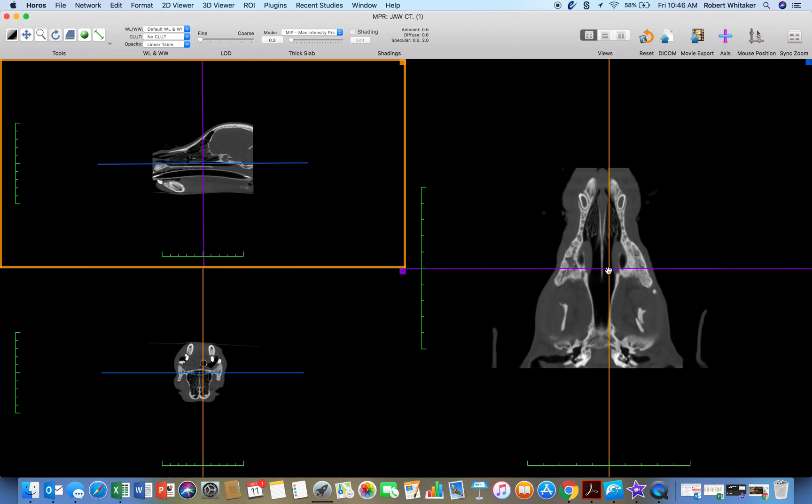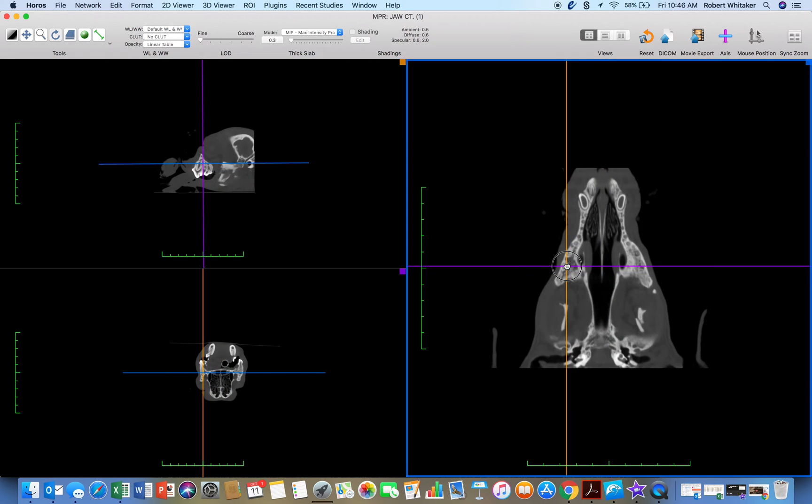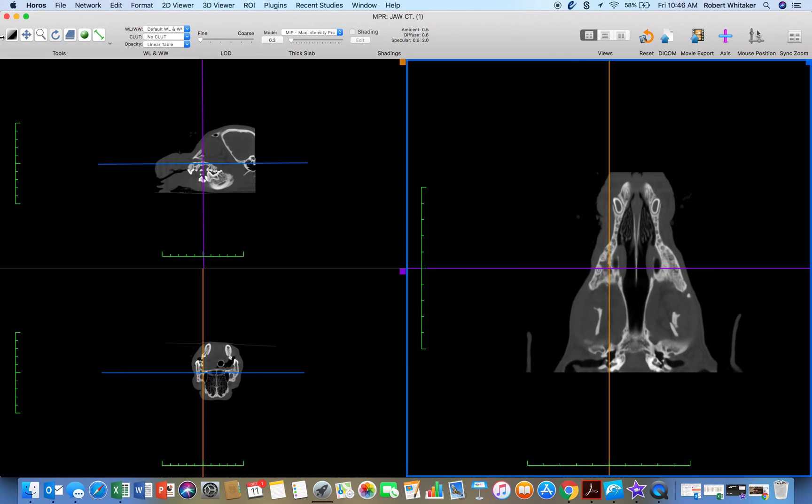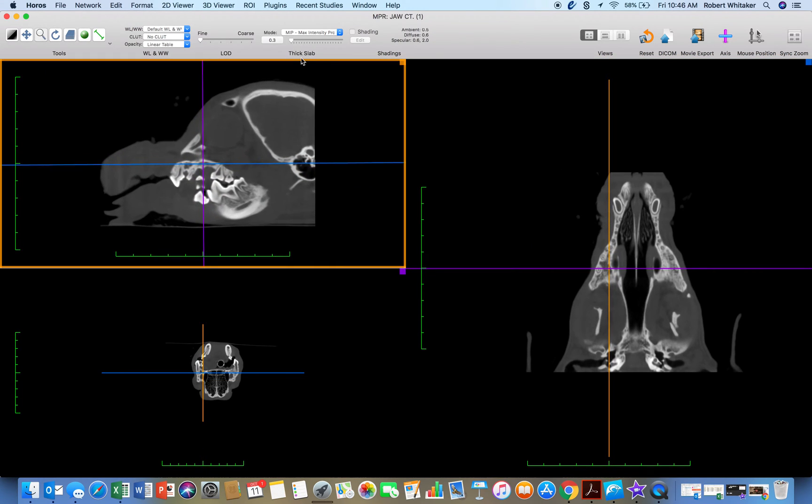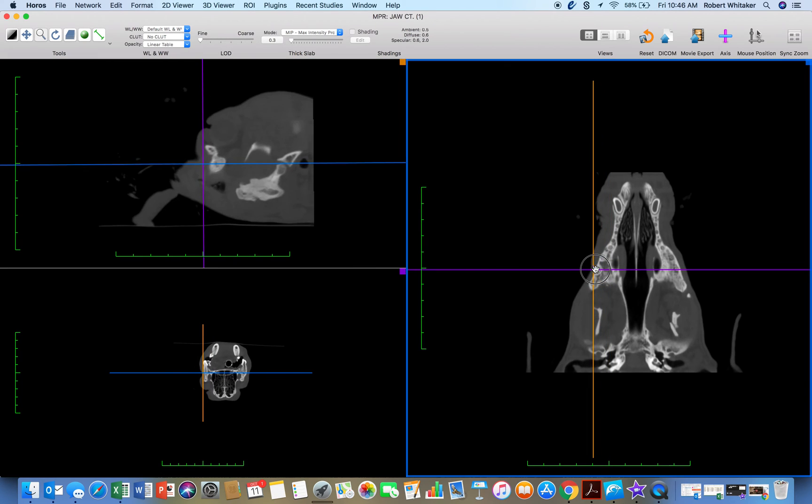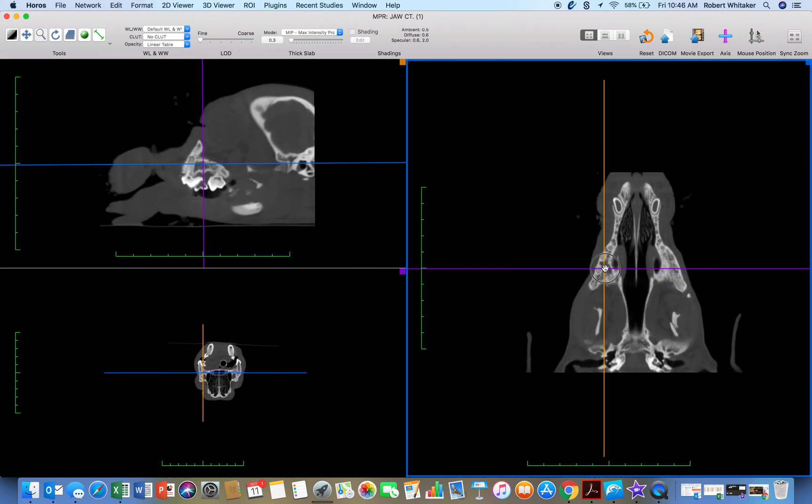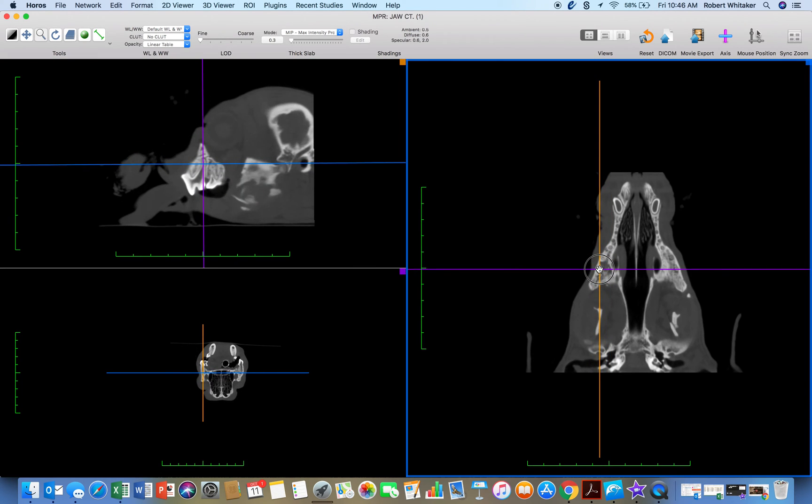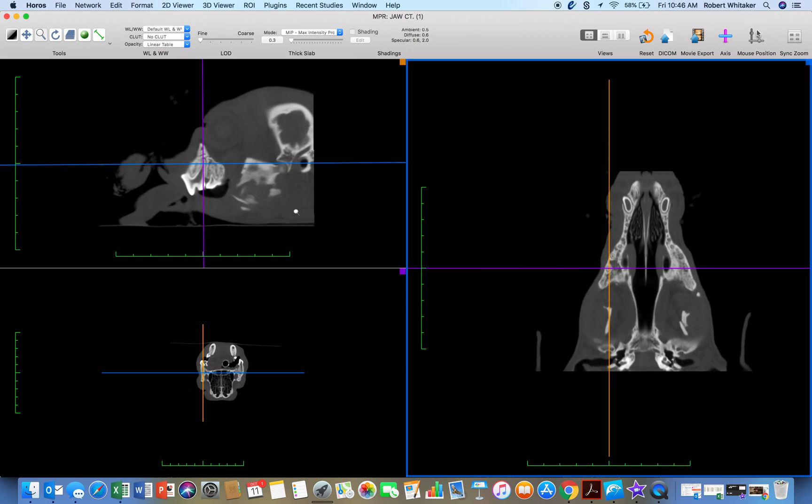You're familiar with this. See all this bone loss here? That's how this works. I hope this helps you. Download Horos from the App Store on your MacBook. It's free. It does not cost money.